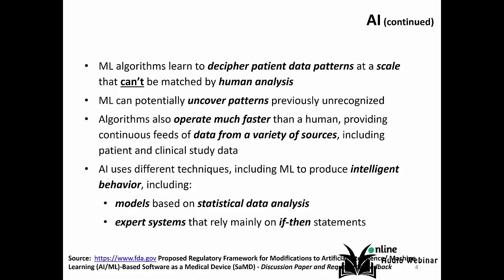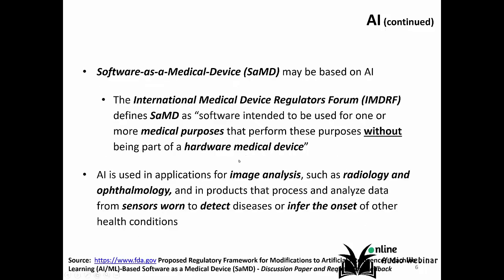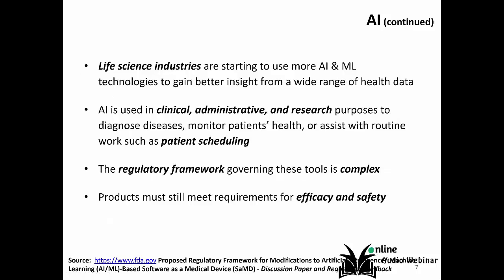The ML algorithms learn to decipher patient data patterns, and they can do this at a scale that you could never achieve with manual or other types of human analysis. Now, software as a medical device is one example, and it can be based on artificial intelligence. The life science industry started using more of these AI and ML technologies to get better insight from a wide range of health data.